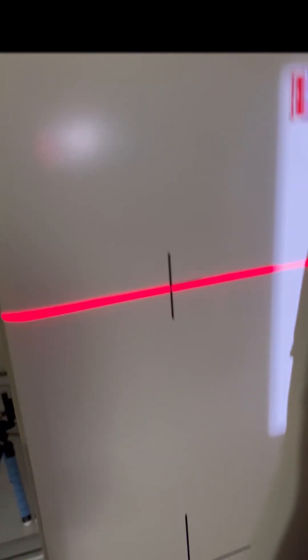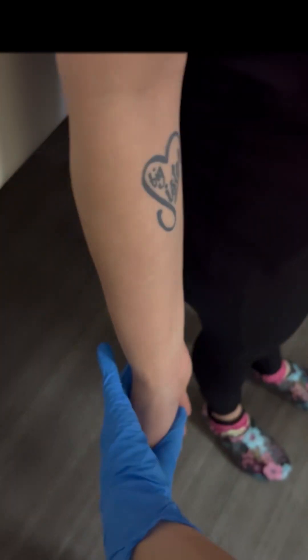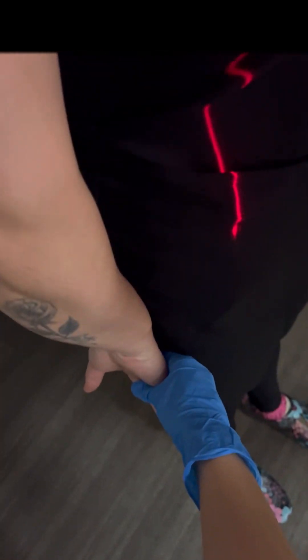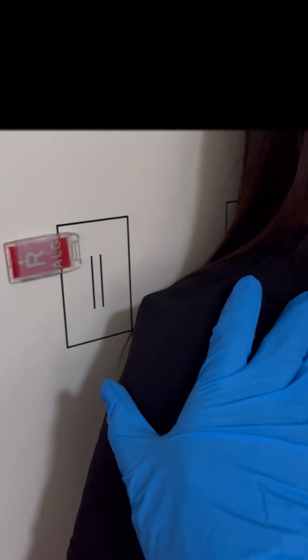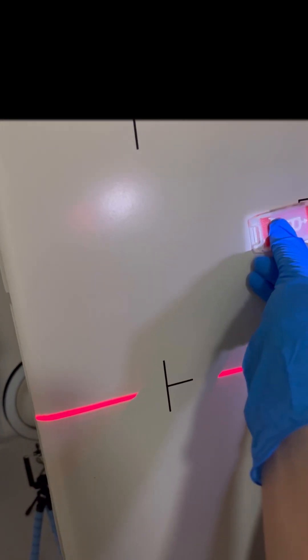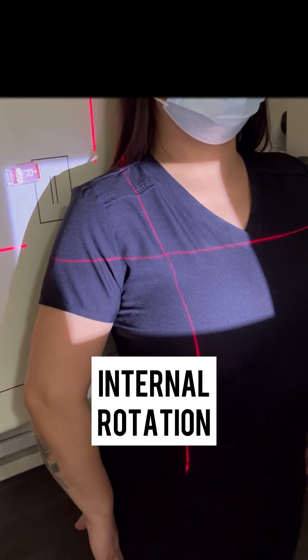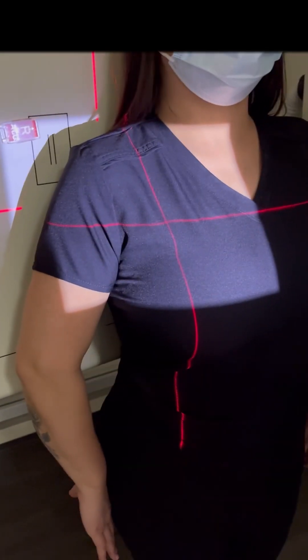For the internal rotation, you put the back of the hand, turn it so that it's kind of to the thigh. Sometimes it makes the shoulder go up forward, so you want to try to put the shoulder back to where it was. Then you put the marker inward, and that would be the internal rotation for the shoulder.